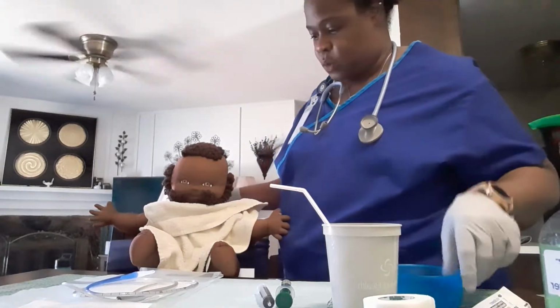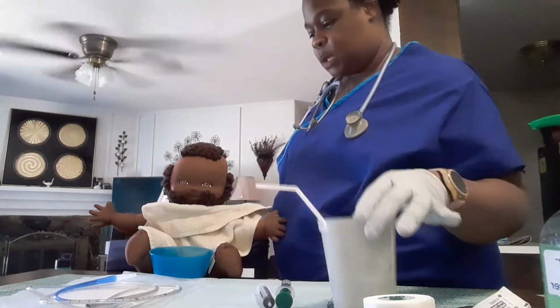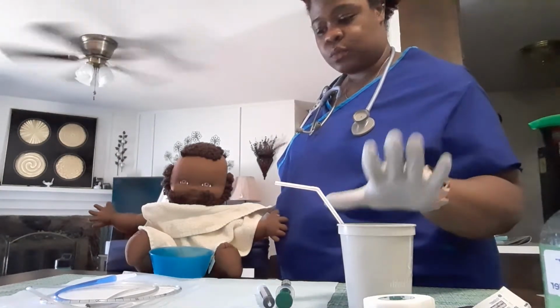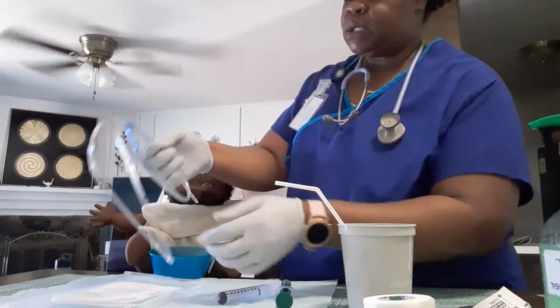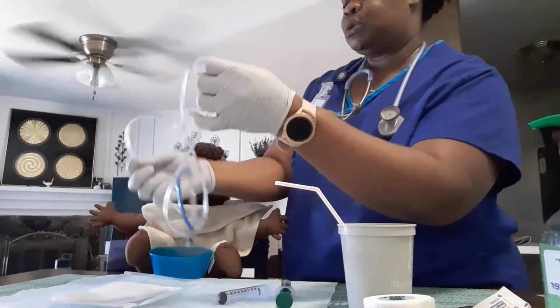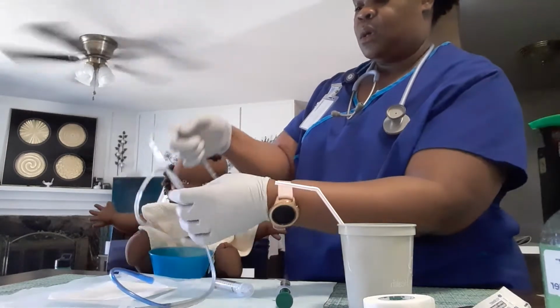I'm going to give him an emesis basin. And I'm going to give him a cup. Well, let's hold off on that. I'm going to take my NG tube and now I'm going to measure. I'm going to measure from the tip of his nose to his earlobe to his xiphoid process.